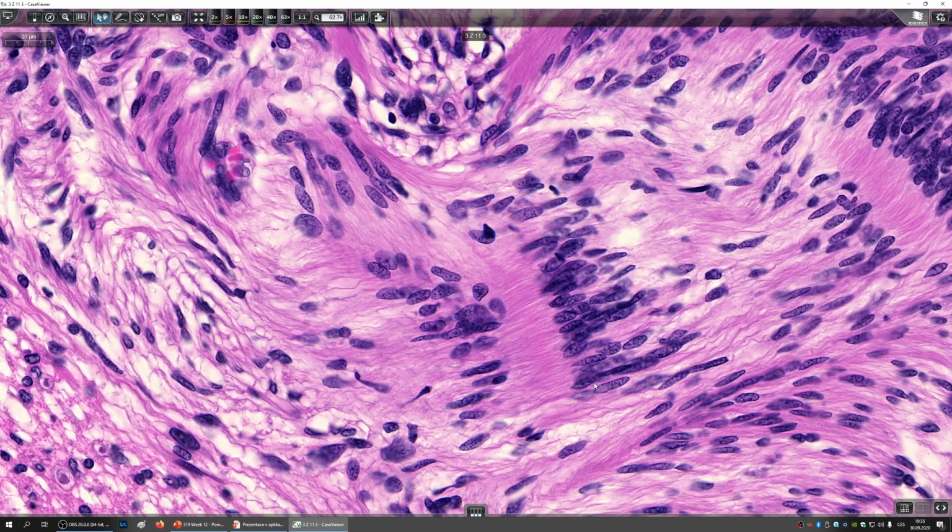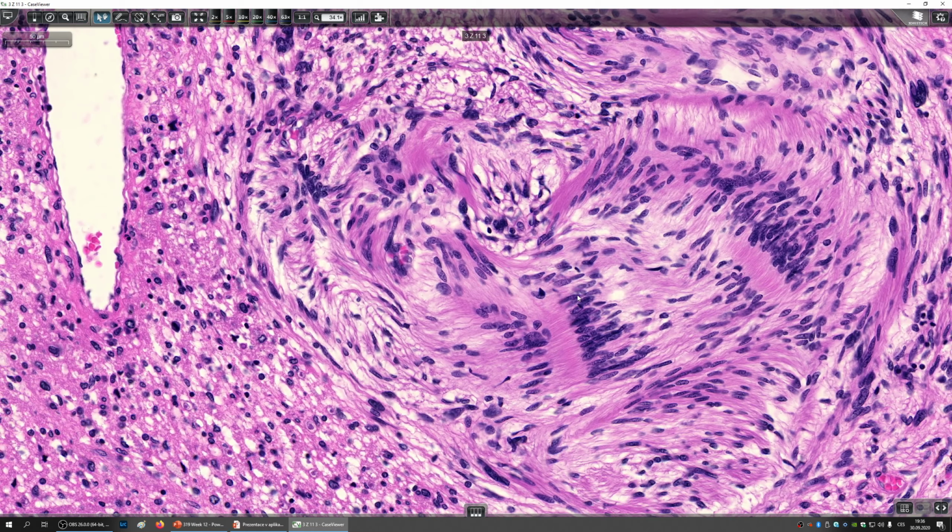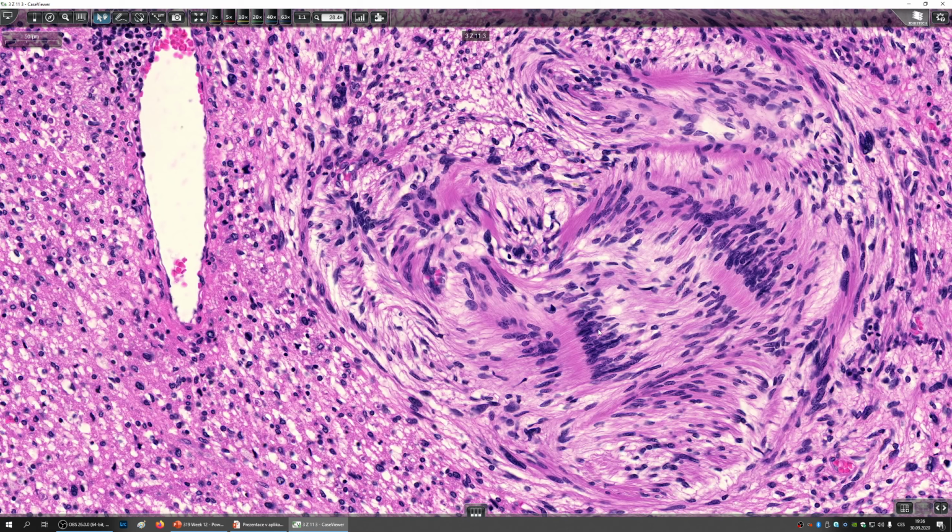So this is a tumor consisting of spindle cells. Here you see the spindle cells with the elongated nucleus. All very small nuclei, maybe slightly hyperchromatic but not particularly atypical, and they palisade. It means that they are arranged parallel like the picket fence in front of the suburban American homes, the white picket fence. This is not white, this is purple. I guess it goes with the times, the color. So purple picket fence, and here you can see that there's a parallel arrangement of one row of nuclei and another row of nuclei, and in the middle you can see these fibers.